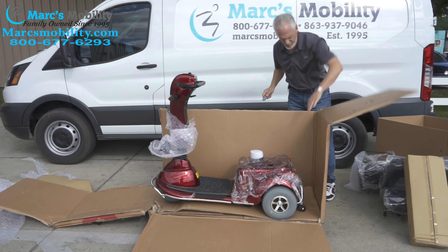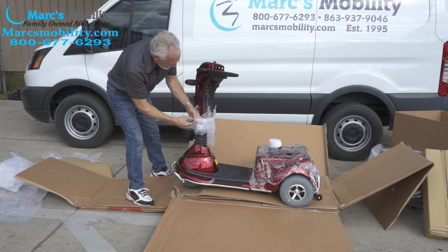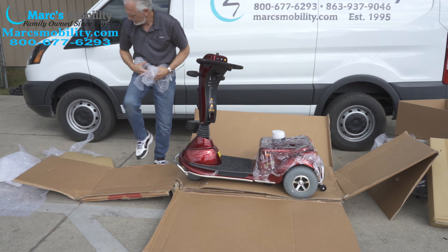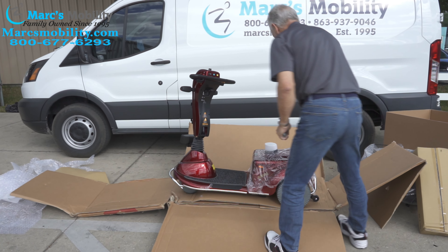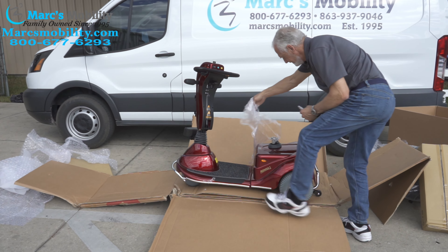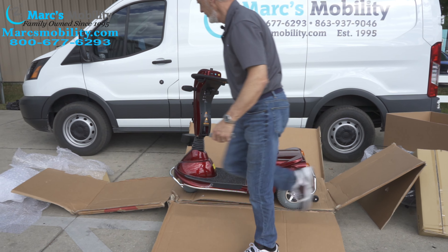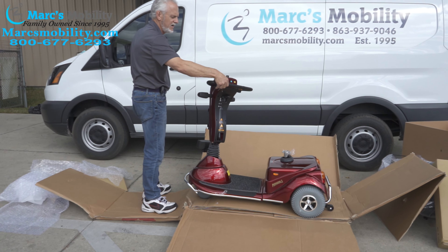Now we've got the scooter sitting there. I'm going to finish taking the plastic off without scratching my scooter. This little cover just sits on top of the seat pole for protection — you can take that off. You can take the plastic off the cover here. The keys for the scooter — on this one they fell in the box, but usually they're tied to the handlebar.